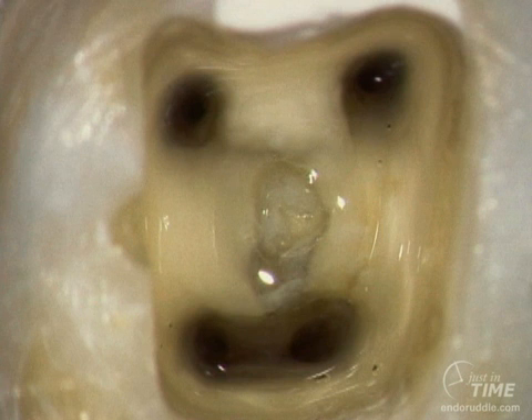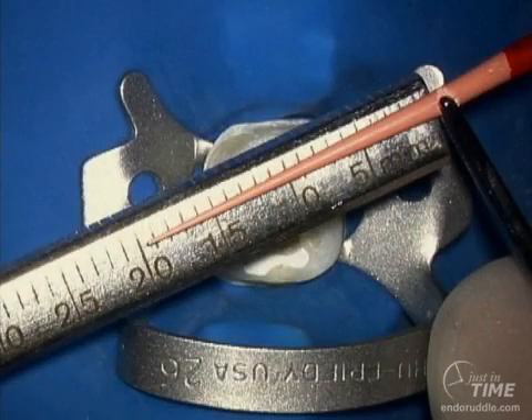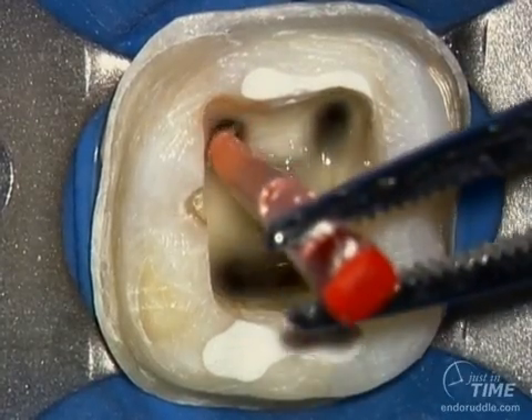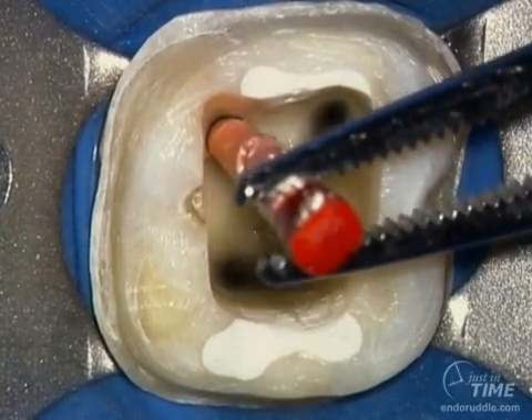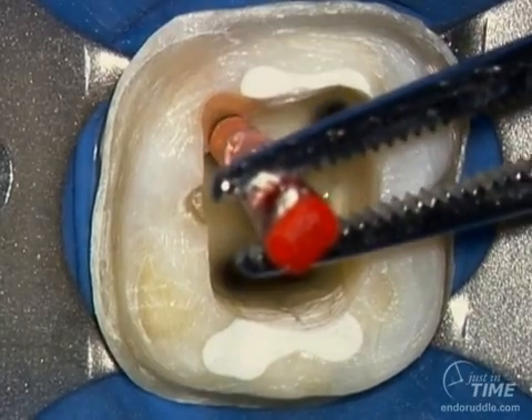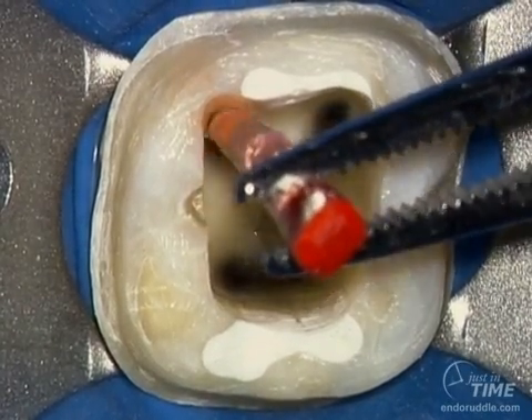In another just-in-time show, we showed how ProTaper can shape most of our posterior teeth with just three instruments. Well-shaped canals are conducive to fitting a cone. So in this instance, we're fitting a ProTaper matching Gutta Percha master cone. The cone is set at the correct length, and the cone is teased into a fluid-filled canal.